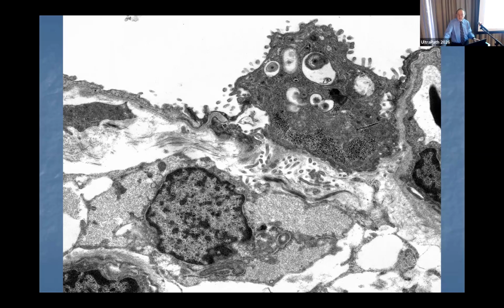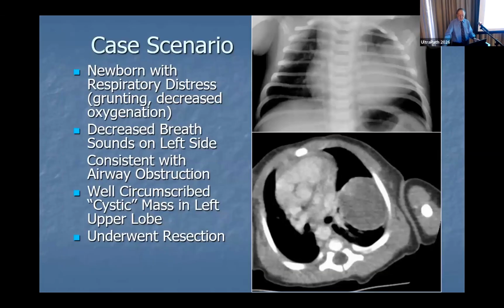Having not a really good history, except the fact that this kid has what seems to be respiratory distress, and no imaging, we get something like this and you say, well, this fits for PIG. But we want to see imaging, we want to see what's going on. And so the child was transferred to us. And this is what they were actually biopsying. They weren't biopsying just the lung, they were biopsying a mass.